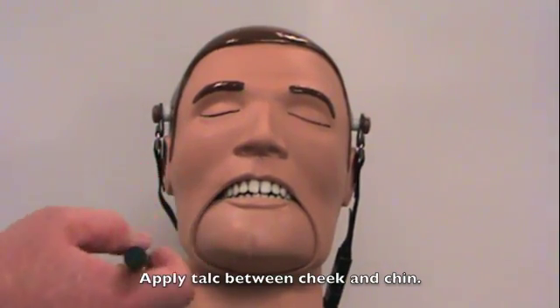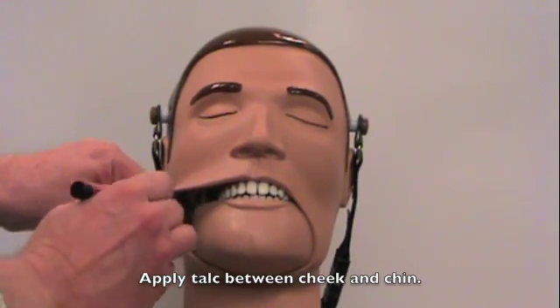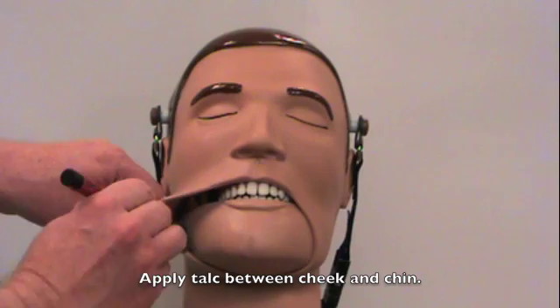Occasionally, apply talc powder between the cheeks and the chin skin to keep your Dexter moving smoothly and to prevent the skin from sticking. Make sure to do the same on both sides.